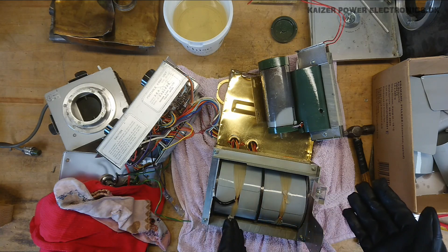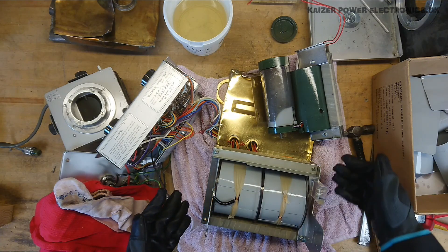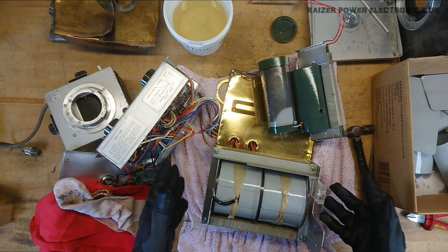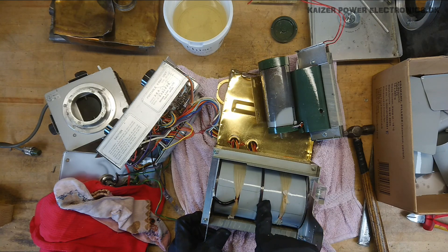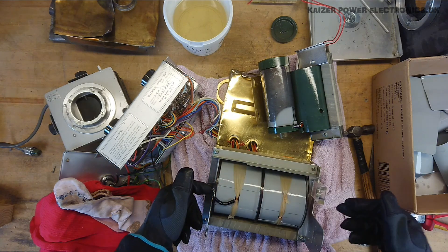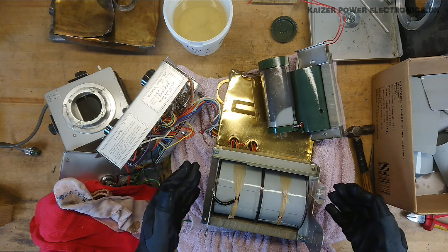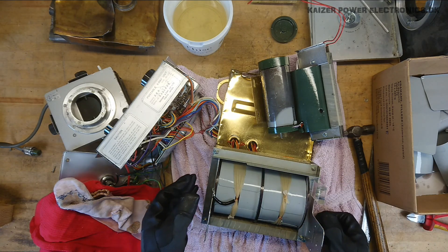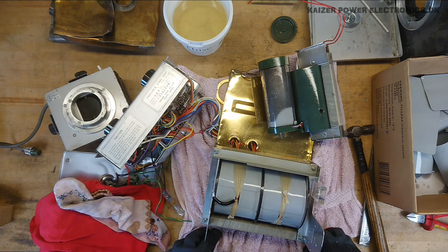If this is a 100 kilovolt transformer, then you would have 100 kilovolt to core voltage difference — that's very hard to insulate. Whereas if you ground the middle of the transformer and you have a plus and a minus side, you only have a 50 kilovolt potential difference between each of the outputs and the core.